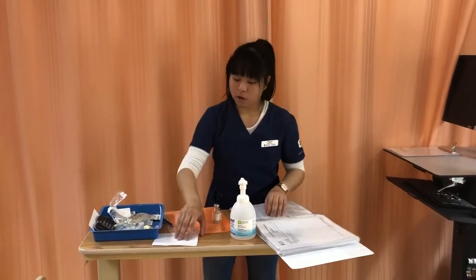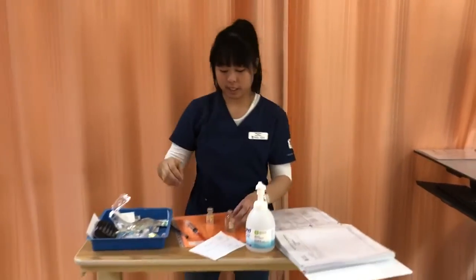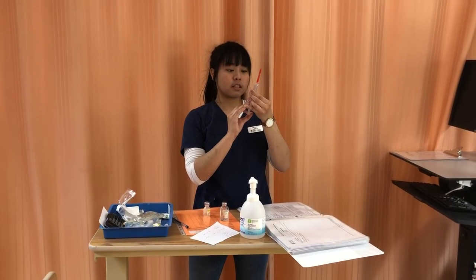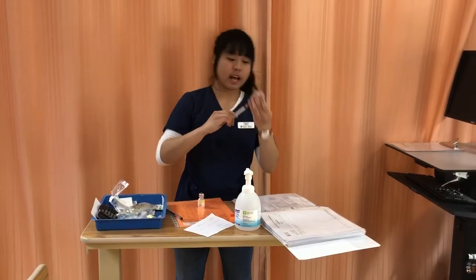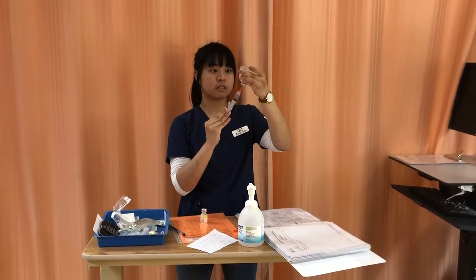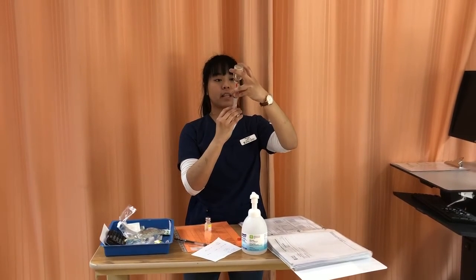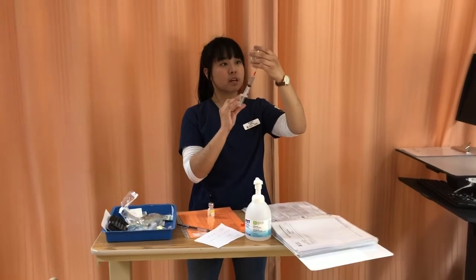And now, according to my calculation, I would need 6 mLs of medication to draw up. So I'm gonna do just that. And I didn't touch the lid of this, so I don't need to swab it again with alcohol. So I'm gonna get that 6 mLs. Inject my 6 mLs of air and aspirate my 6 mLs of medication. And then I am going to label my tubing so my colleagues know what to change. I'm gonna take out my excess air bubbles, recalibrate, take out my medication as well.